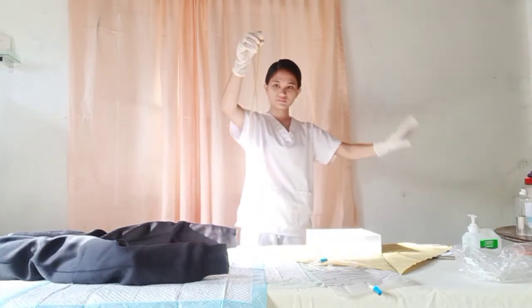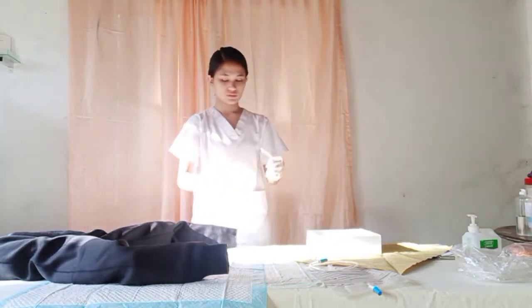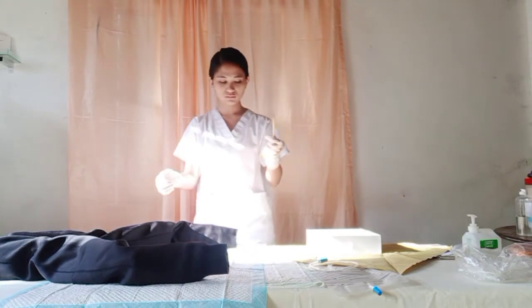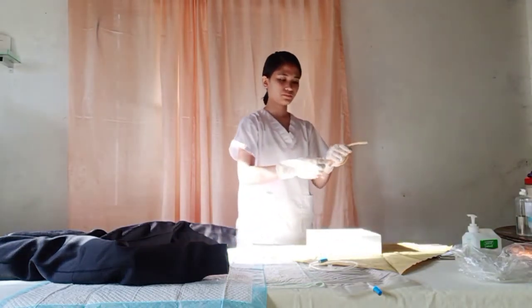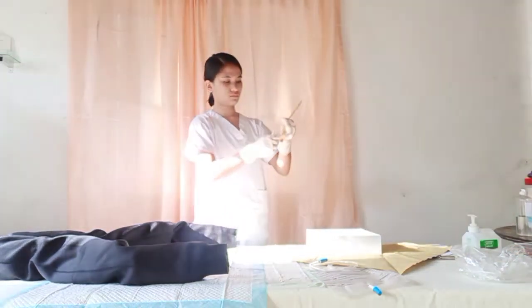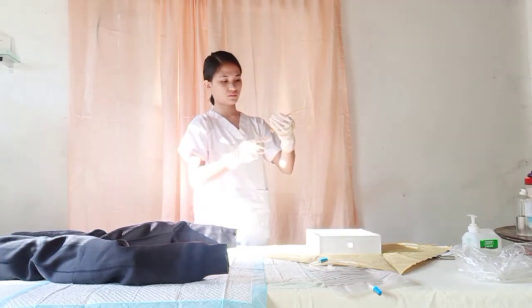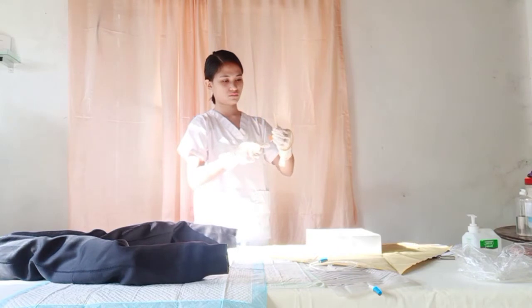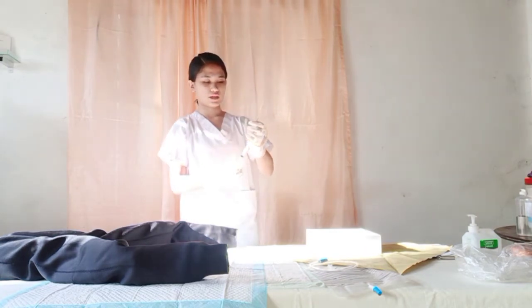Discard. And then test the balloon. It is working. Now I can see that it is working.